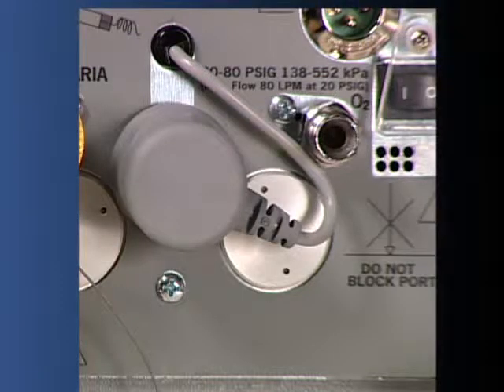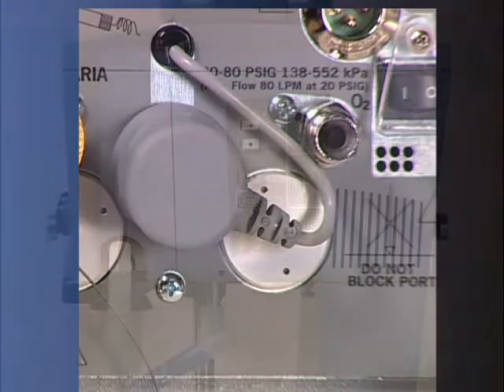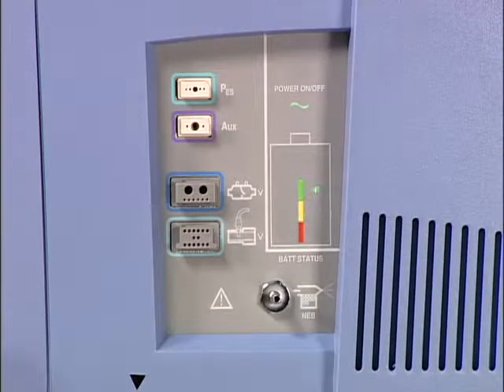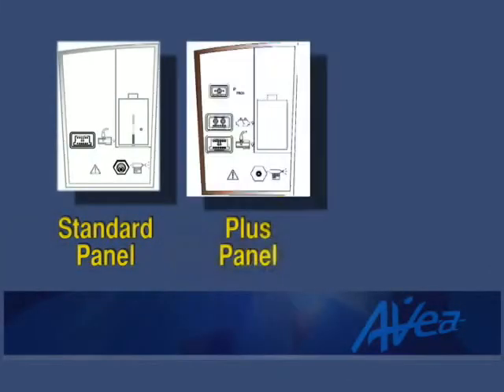The oxygen monitor cell is located between the two high-pressure gas connectors. The cell may be changed while the ventilator is in operation without interrupting ventilation to the patient. The front panel of the ventilator body contains all of the patient connections. The inspiratory limb of the patient circuit connects to the gas output of the ventilator, and the expiratory limb connects to the exhalation filter system. Connections on the front panel will vary depending on your particular model of AVEA. Please consult your operator's manual for a detailed diagram of each configuration.